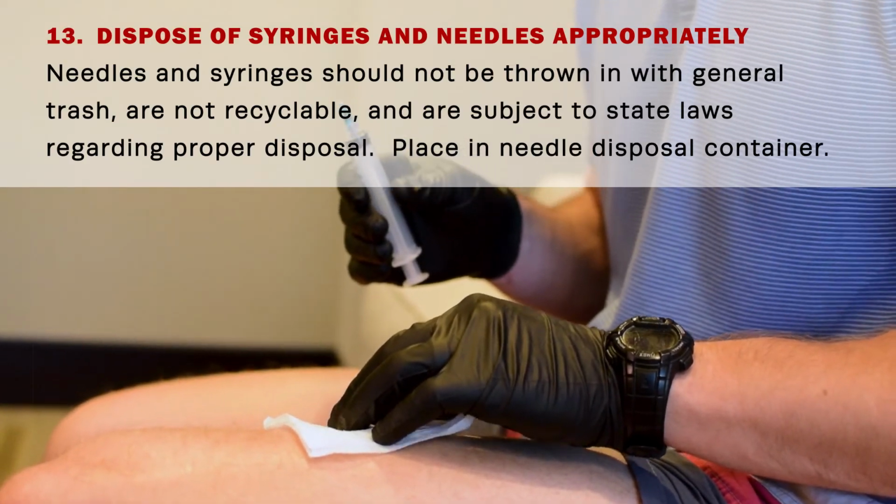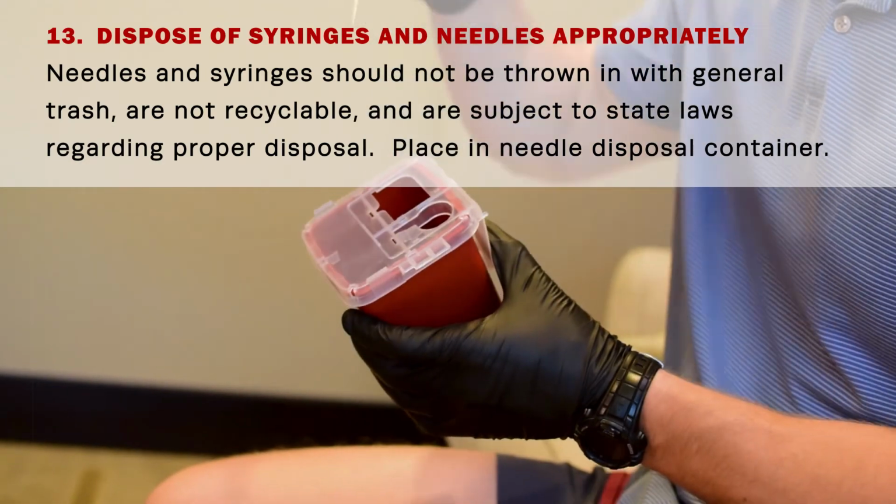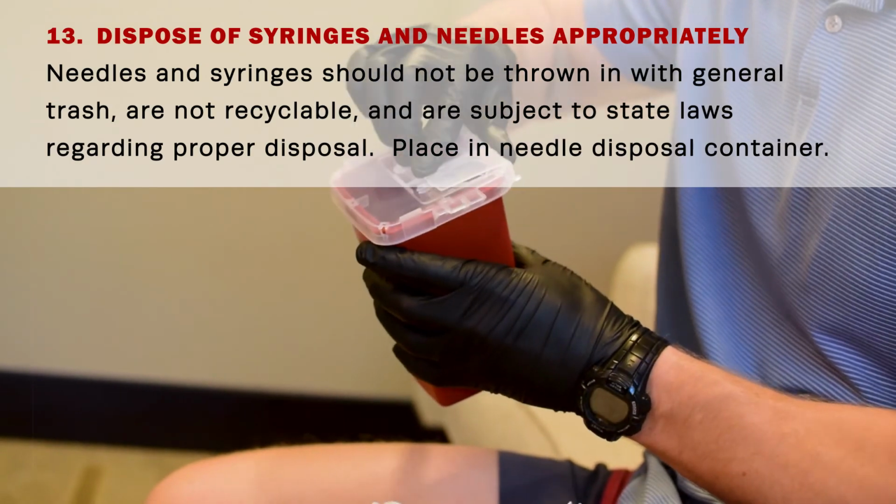Needles and syringes should not be thrown in the general trash, are not recyclable, and are subject to state laws regarding proper disposal. Be sure to dispose of your needles and syringes appropriately.